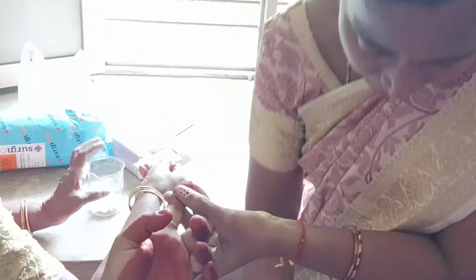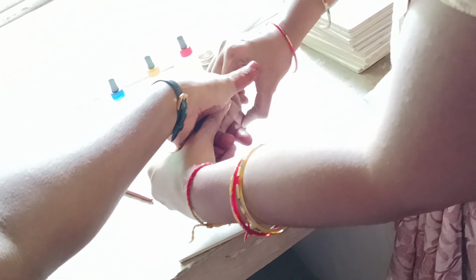See, after this I am disposing of the needle here. I am not using this again. Now we will first wipe off the first drop and then take three drops. These are the three drops we have taken here.